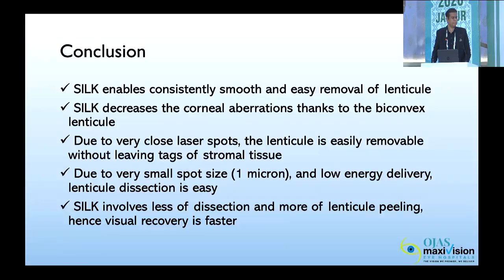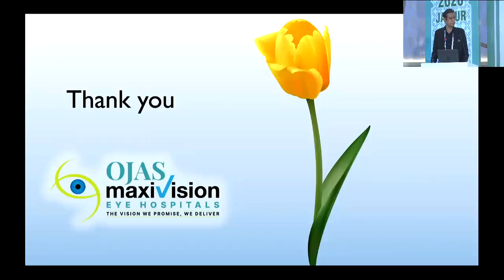SILK involves less dissection and more lenticule peeling, hence visual recovery is very fast. Thank you very much.